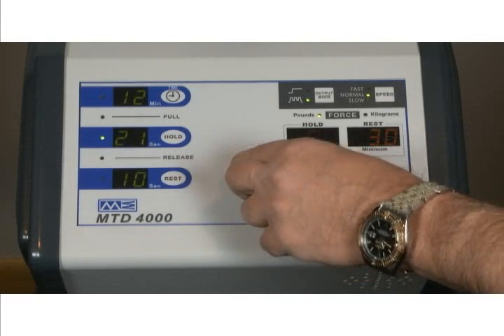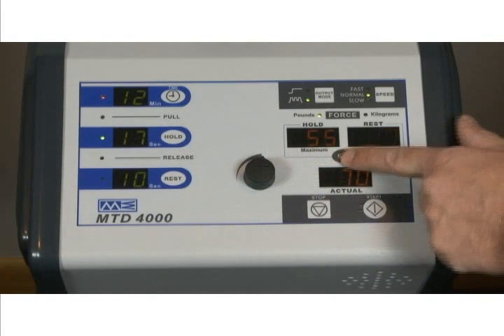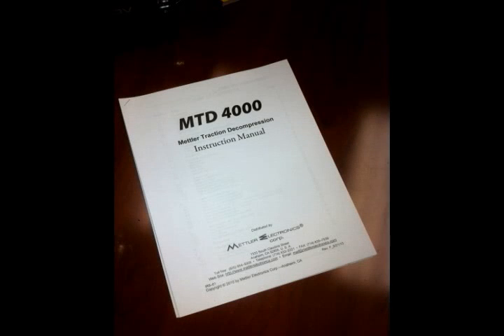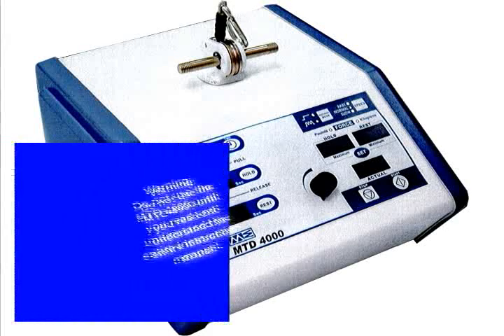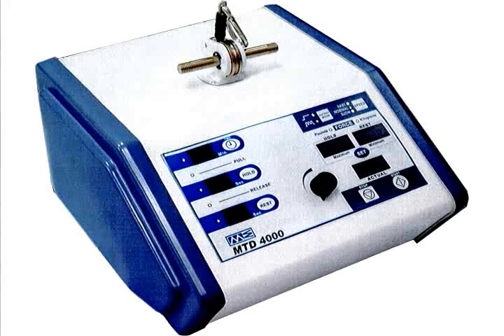This video has been produced to assist you in the safe operation of the MTD4000 and is not intended to replace the operator's manual. Do not operate the MTD4000 until you have read and understood the entire instruction manual. The MTD4000 system offers static, intermittent, and cyclic traction with user-definable pull patterns.